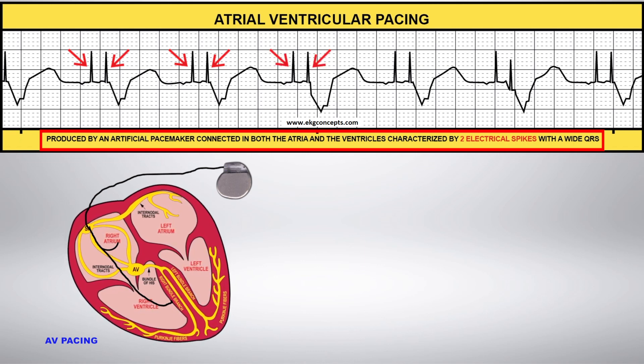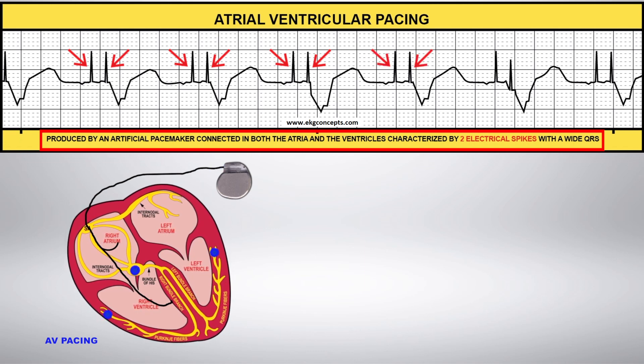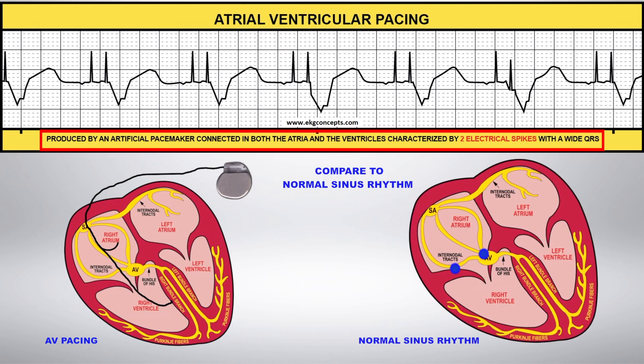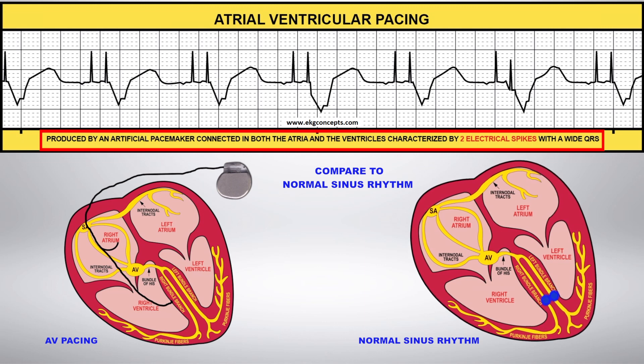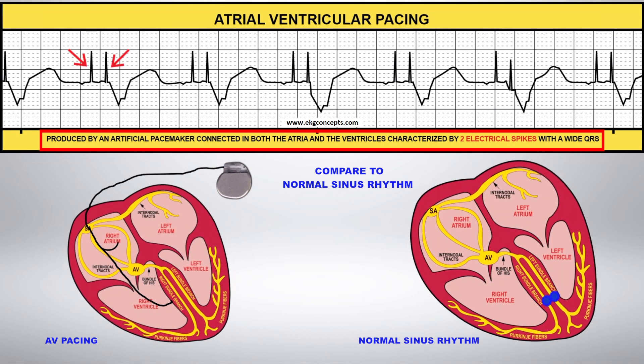The characteristics of AV pacing are two electric spikes followed by a wide QRS. Compare this rhythm to normal sinus rhythm.